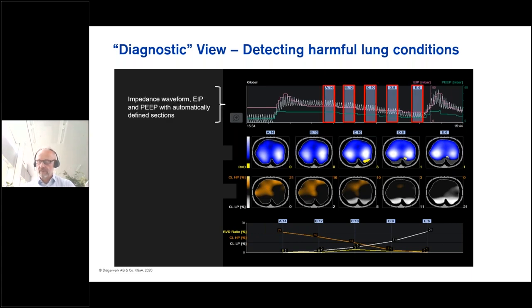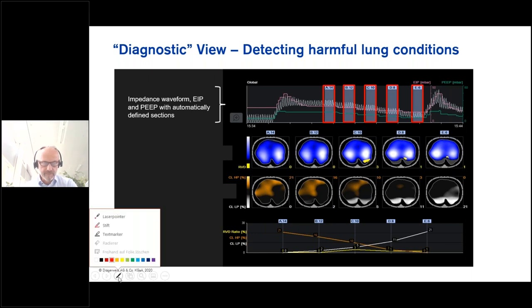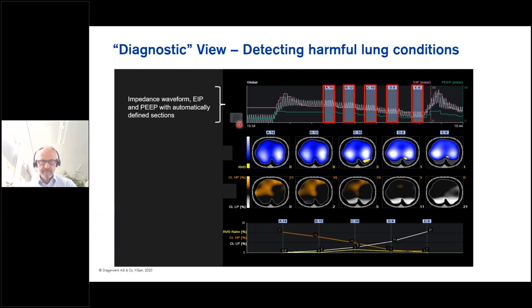So first of all, in the upper part, we basically display, and I will put on my pointer now right here so that I can better demonstrate. So in the very upper part, we see basically the impedance waveforms, and we have studies where it was proven that the impedance waveforms can basically be taken as volume waveforms. So the correlation between a volume waveform and an impedance waveform is extremely high. Except on a ventilator, you typically do not see those offsets.